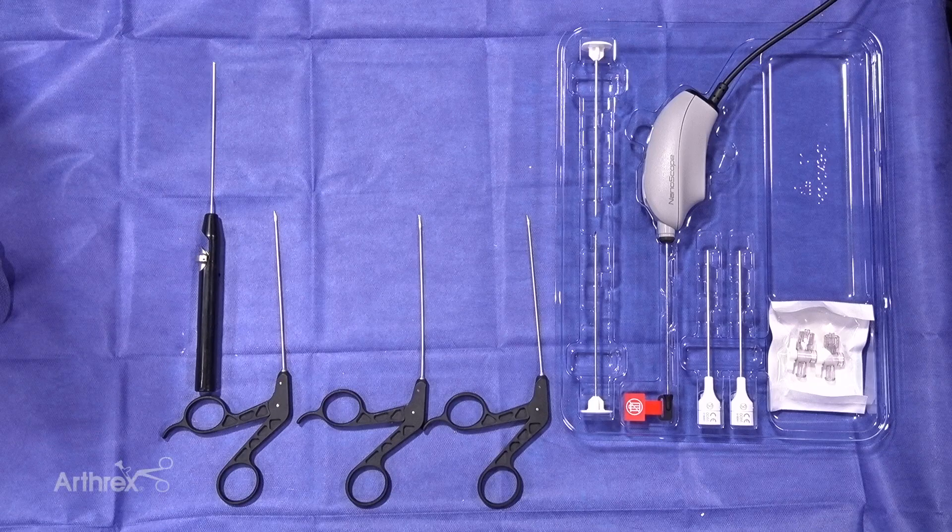Today we're going to introduce you to the peel pack for a transformational technology known as the nanoscope. What makes the nanoscope special is that the scope is two millimeters — standard arthroscopy for the upper extremity, specifically hand, wrist, and elbow, is much larger, at least double the size. There's a one millimeter sensor on the end of the scope that allows you to have unbelievable visualization. It really will be a transformational tool in allowing us to improve patient care.